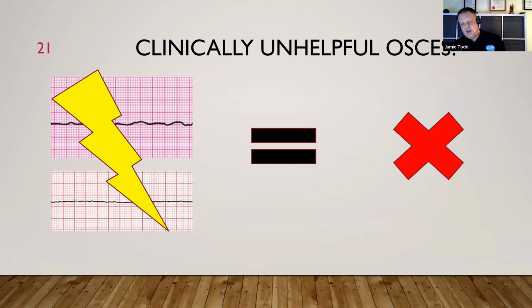And the way I like to run ALS teaching is, should our question be much simpler than that? Not is it shockable or non-shockable, but why is this not a shockable rhythm? My default position is this is a shockable rhythm, and I look at the rhythm and go, why is that not shockable? Okay, that's not shockable. But my default is always edging towards the safe. And I think that's a much better mindset to apply to many things. Why shouldn't I do this? This is the safe thing to do. Why shouldn't I do this?